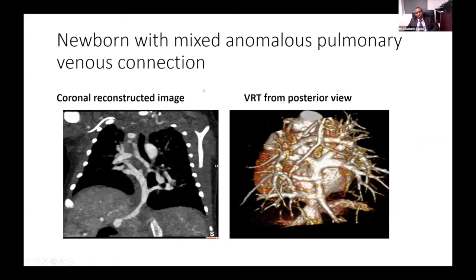This is a newborn with mixed anomalous pulmonary venous connection. We were taught pulmonary veins are four — two on each side — but with this advanced imaging technique we are seeing really more than that. You can see this mixed total vein going to the portal hepatic system, a vertical descending vein, and at least three veins attaching to the confluence, two veins on the left side, and an additional vein heading up to the SVC — one from the right, one from the left. Looking from the back of the patient, you can see like seven pulmonary veins in this patient.